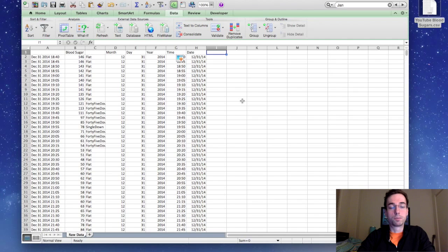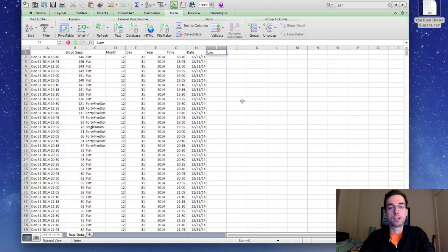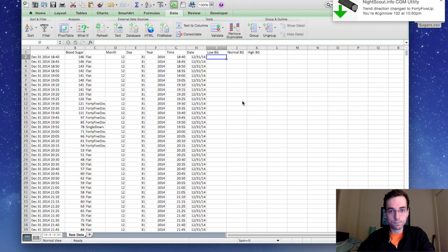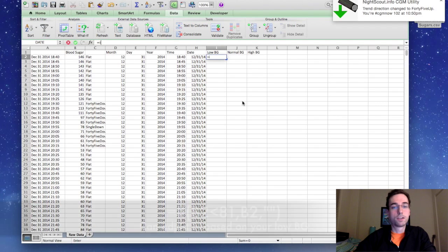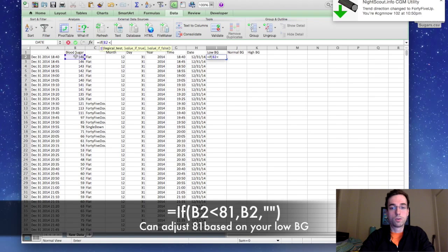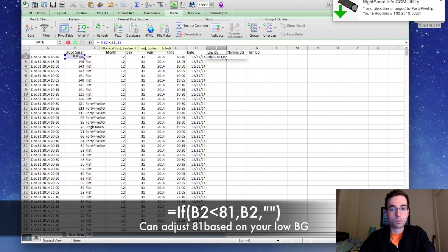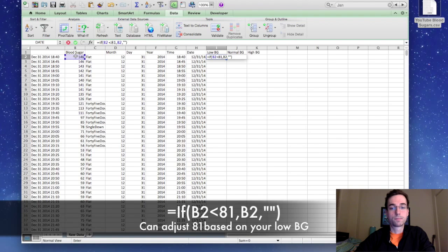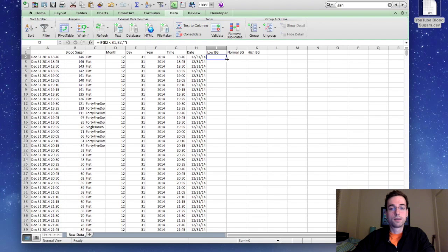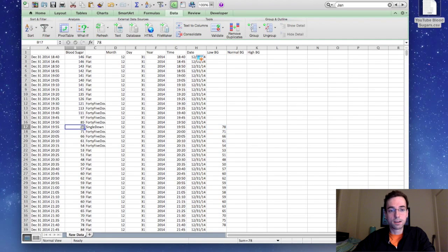Okay, the next thing we're going to do is we're going to change the blood sugar values. Instead of just having one column of blood sugar, we're going to have three columns of blood sugar. So we're going to label column I low BG, J we're going to say is normal BG, and K we're going to say is high BG. Okay, so in column I, the formula we're going to add is an if statement. So if B2 is less than whatever you want. So for me, a low blood sugar is anything 80 or below. So I'm going to say B2 is less than 81. I want to report B2, and if not, I'm going to leave the cell blank. So to leave the cell blank, I just put in two quotes. Okay, and so for example, this blood sugar reading was 146. So for low BG, it shouldn't read anything because I didn't have a low blood sugar value. Then I'm going to drag this one down by double-clicking, and you can see when I have a 78 here, it's a low blood sugar, so it'll populate in this.